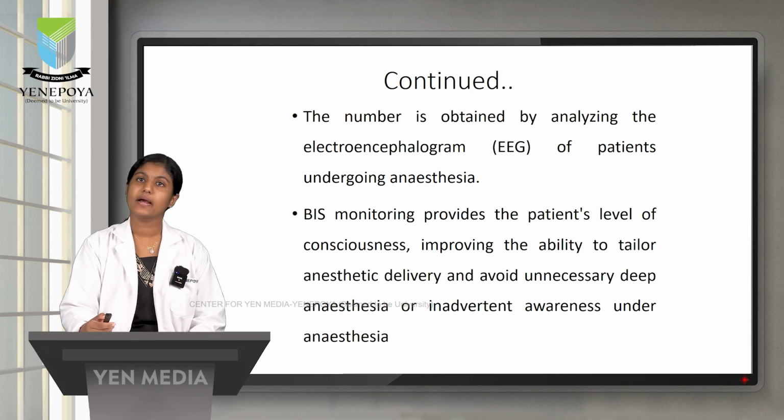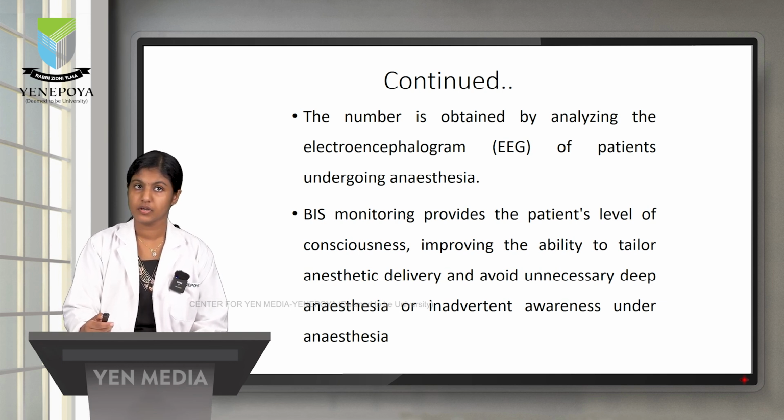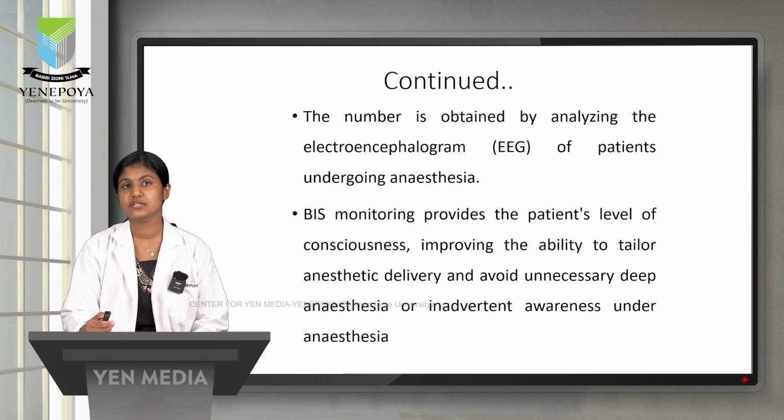This number is obtained by analyzing the electroencephalogram of patients undergoing anesthesia. BIS monitoring provides the patient's level of consciousness, improving the ability to tailor anesthetic delivery and avoid unnecessary deep anesthesia or inadvertent awareness during anesthesia.